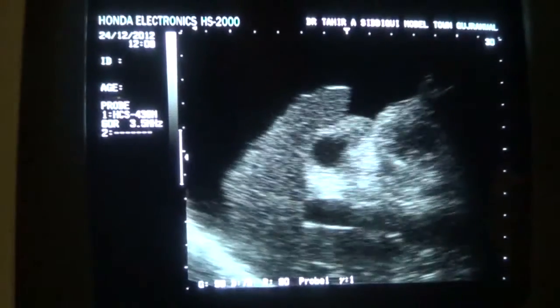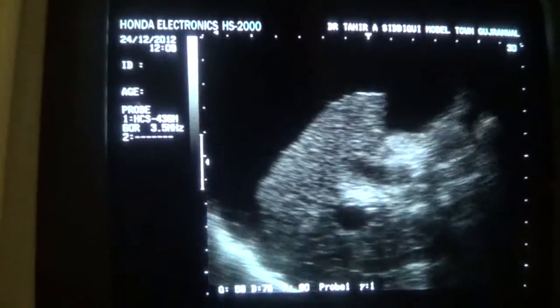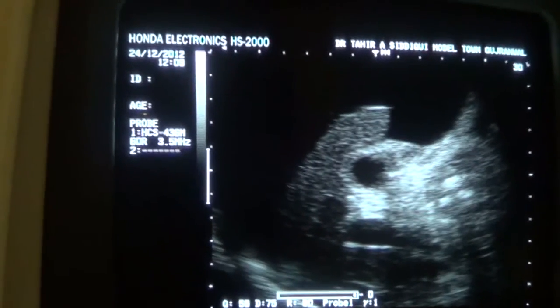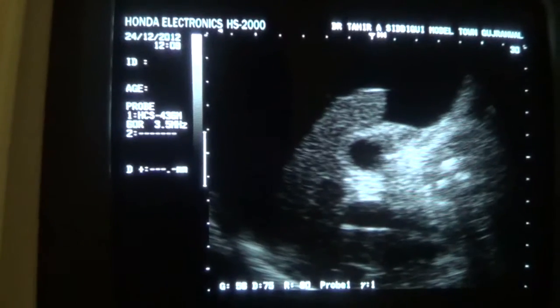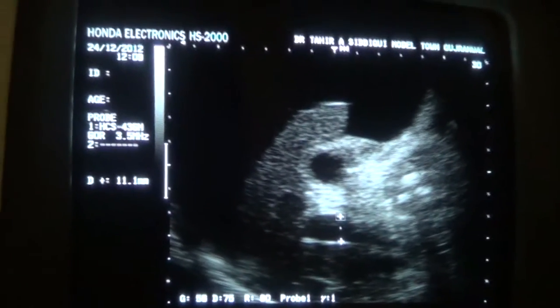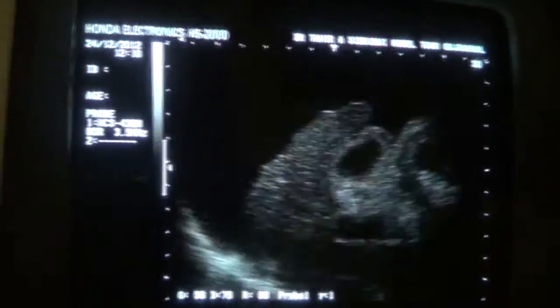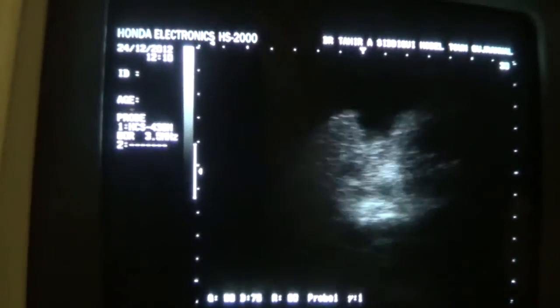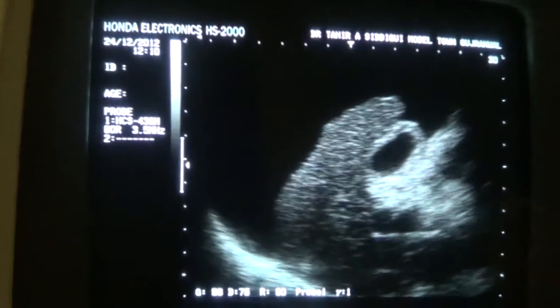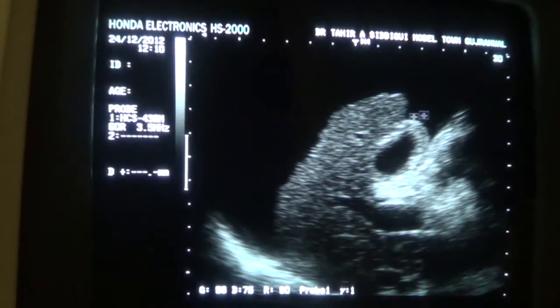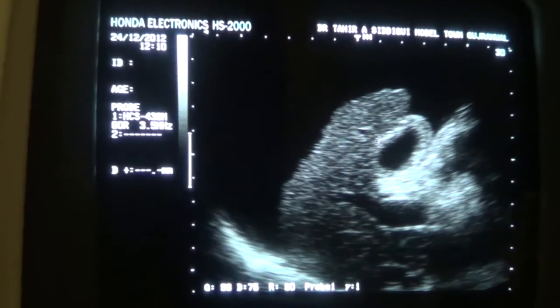Regarding the portal vein, in such cases we measure the portal vein from inner to inner. The dimension is 11.1 millimetres — normal is up to 13 millimetres — so the portal vein is normal and not dilated. Note the walls of the gallbladder appearing thick because of the fluid surrounding the gallbladder wall.